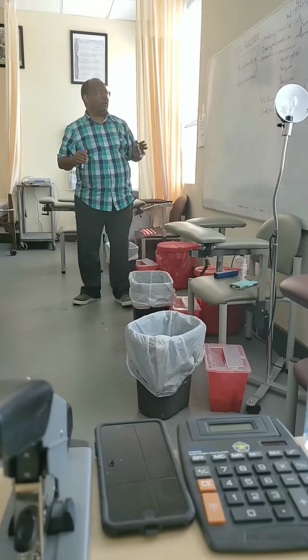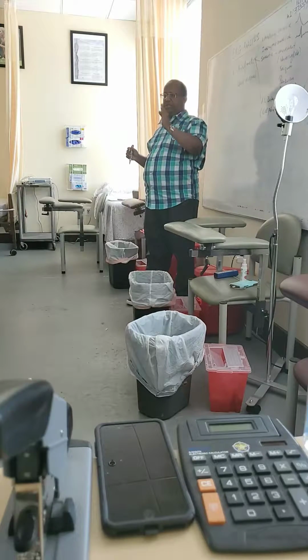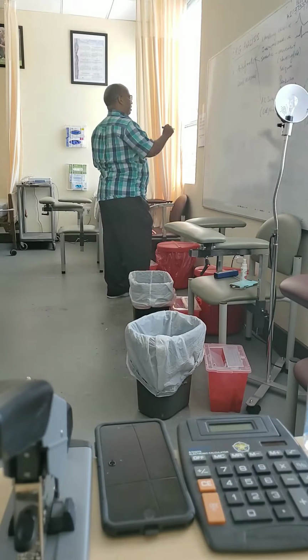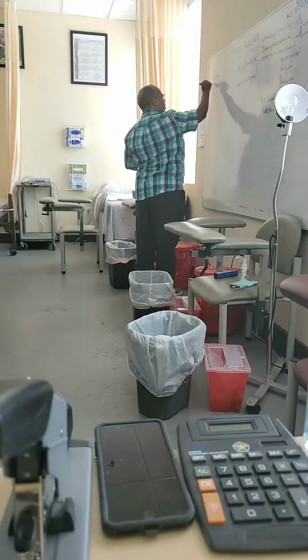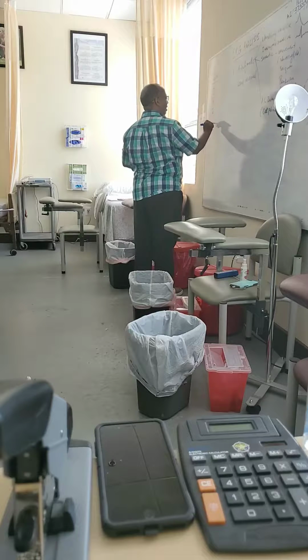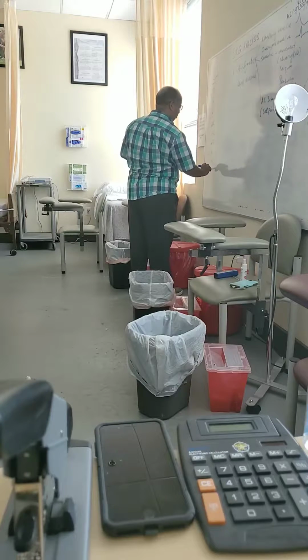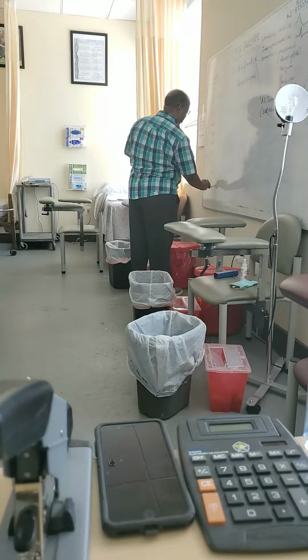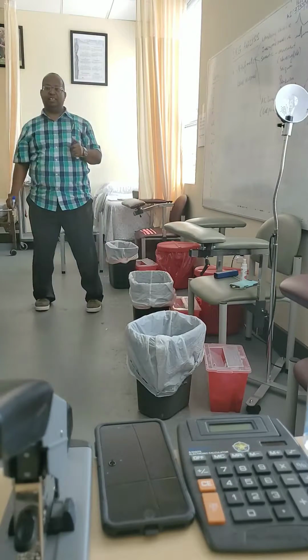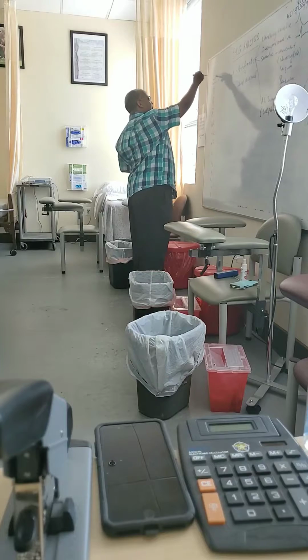Lead reversal. It means you will get 12 leads on your paper. How many leads? 12. I will discuss it later. It is lead 1, lead 2, lead 3, AVR, AVL, AVF, then V1, V2, V3, V4, V5, V6. These are the 12 leads.